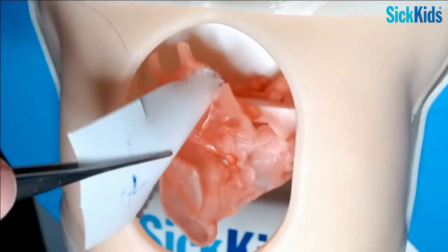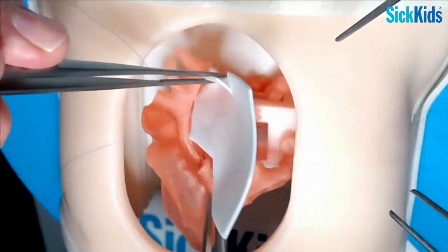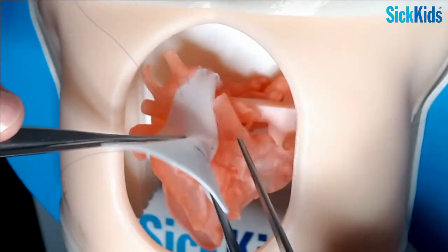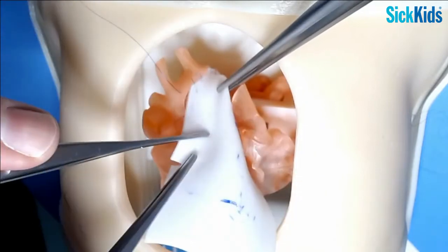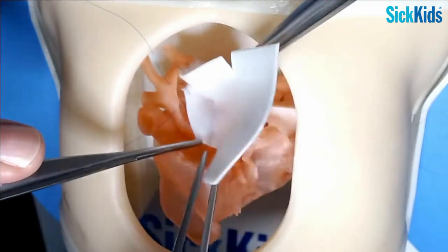Now you've got your basic arch built, and all you've got to do is fit the PA inside of there. So you can see where that PA wants to sit. Put a mark right there. And you know where this cut is here because you made it already. And now you've got enough sewn to know where this cut needs to be.